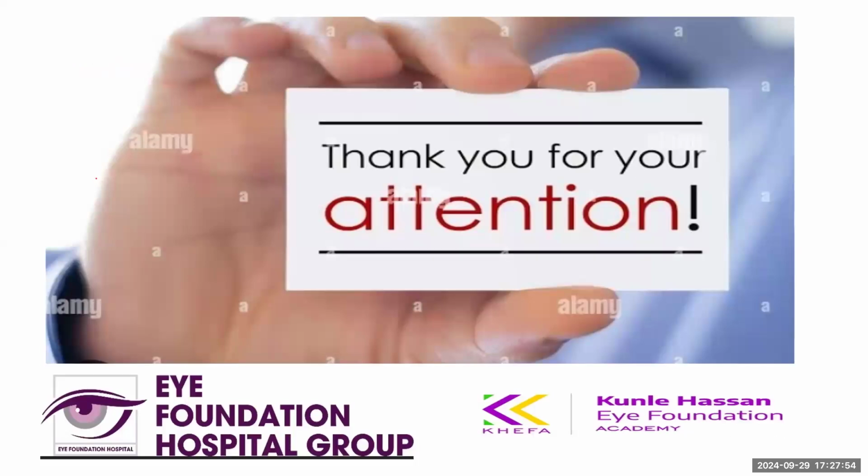Let me check if there are other questions on the forum and other contributions. Someone said, please throw more light on the value of the peripapillary vessel density. Okay, the density, as the name says, is just checking the quantity of the capillaries around the optic nerve head.